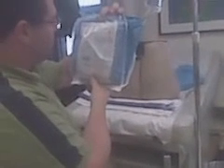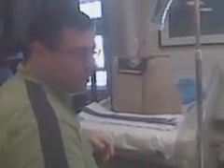I've already washed my hands. I'm going to find myself a spinal tray. This is a spinal needle tray. On the back we have a list of what's in it. We want to assess that it has the medication that we want to use based on the duration of our procedure and such. We want to make sure that we're going to use an appropriate local anesthetic. And if we want to add any sort of narcotic for additional analgesia, we'll go get that, whether it comes from the Pyxis or from a lockbox, or if it needs to come straight from the pharmacy. We actually have a list here.